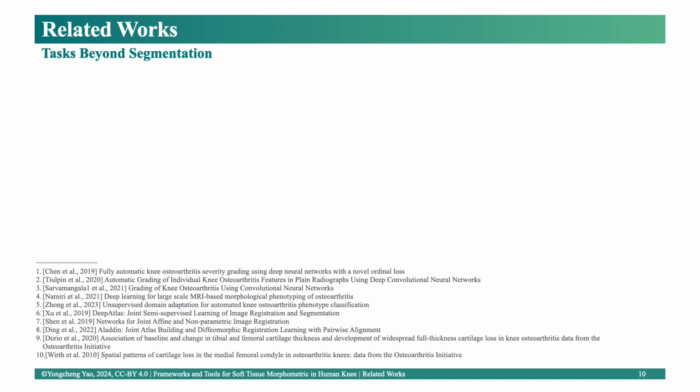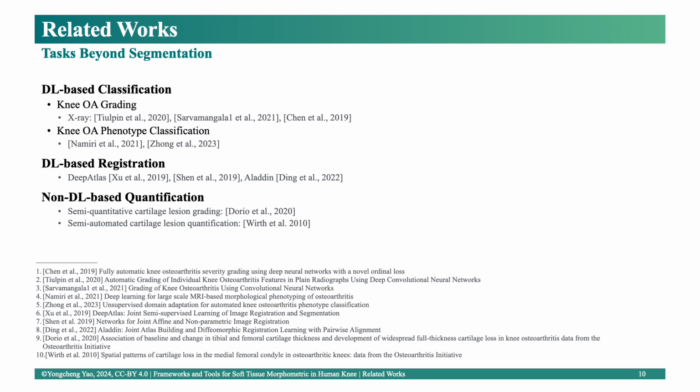Here, I summarize relevant studies in deep learning and medical image analysis for knee osteoarthritis. Deep learning-based image classification tasks mainly include severity grading and phenotype classification. Some registration models have been developed on knee image datasets, and there are semi-quantitative or semi-automated quantification methods.